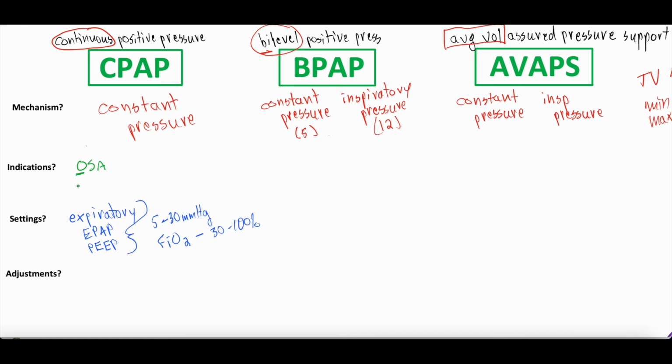You also can use CPAP for COPD, chronic obstructive pulmonary disease, also known as emphysema. You can use BiPAP as well, but in COPD, you get some destruction and mucus buildup in those small airways, so stenting them open with CPAP can be helpful.